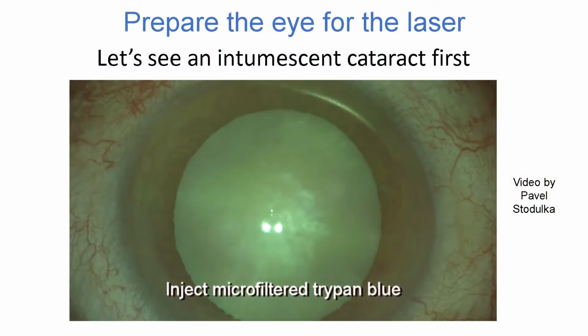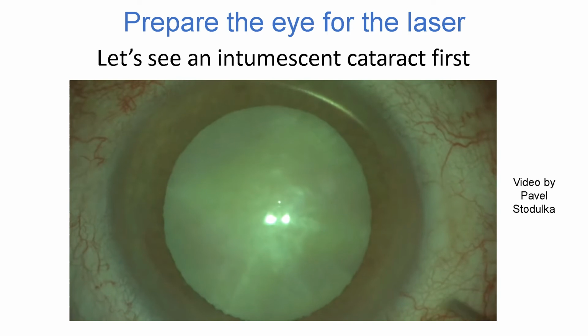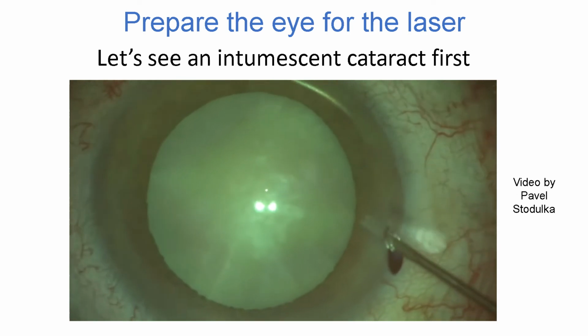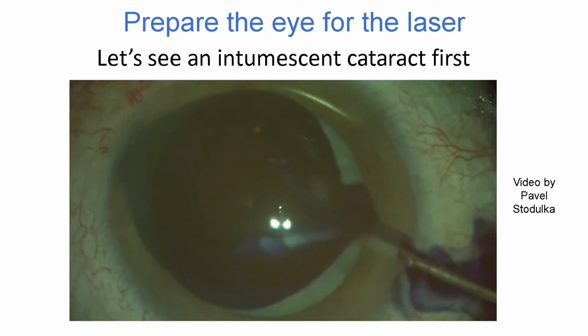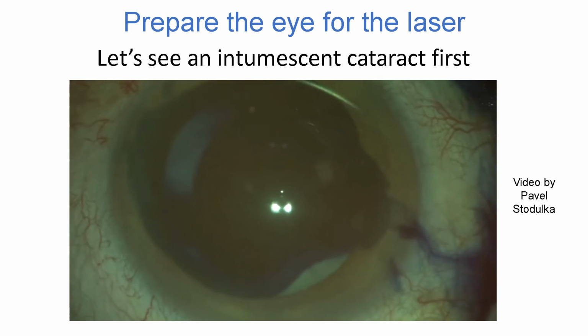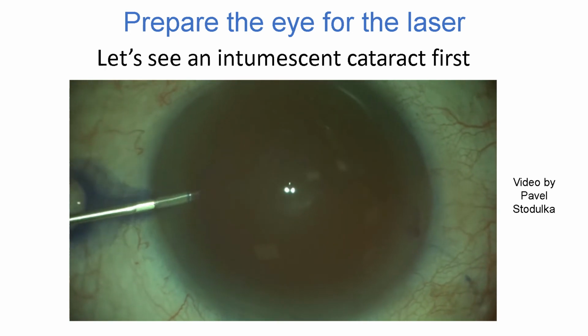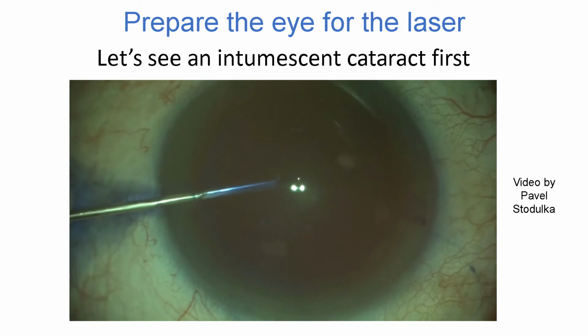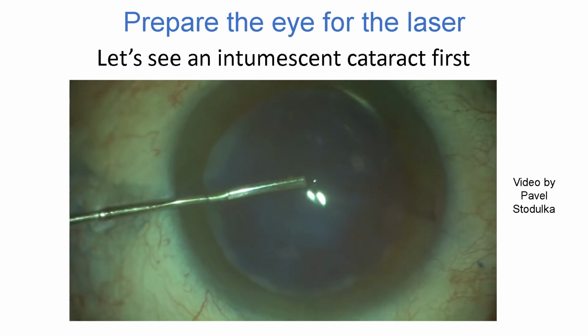Now let's see what happens as we prepare the eye for the laser. And first we're going to see an intumescent cataract. This is from a video by Pavel Stodulka. The first thing that we do is to inject the microfiltered trypan blue 0.4% solution. Its specific gravity is heavier than that of aqueous, so when injected slowly it drops down onto the surface of the anterior capsule and is left there for about 30 to 60 seconds and then is carefully washed out, and it's important to do this.